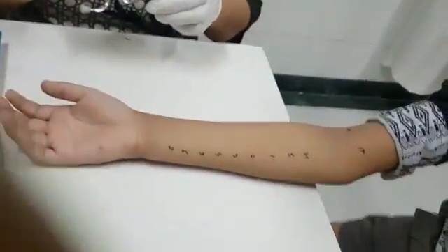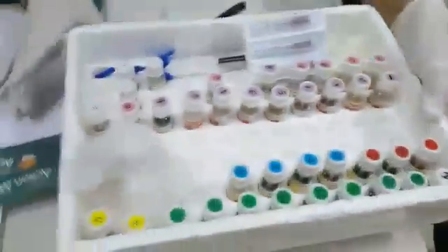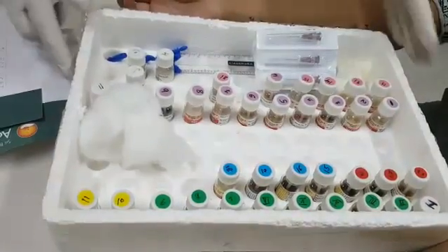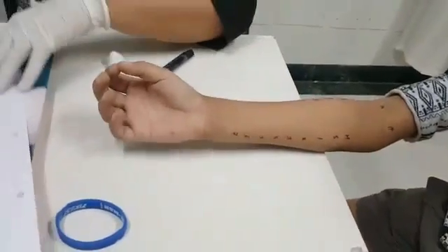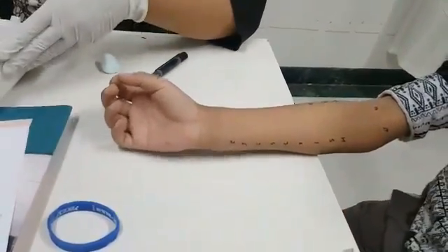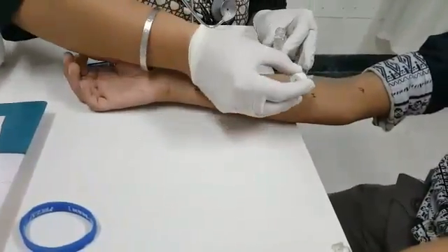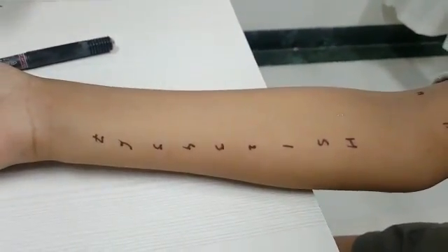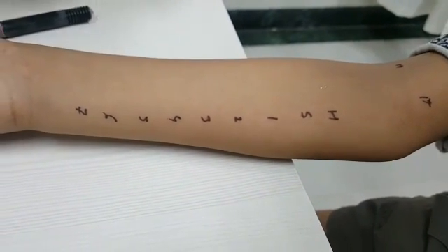Now we leave this hand and take the other hand. We generally put drop by drop. This is the allergen kit — it contains a group of aero allergens and food allergens. We do it in children and there is no harm in it. Now we open it and put the control first. This is the way we put the drop on the skin of the child and there is nothing to worry about.